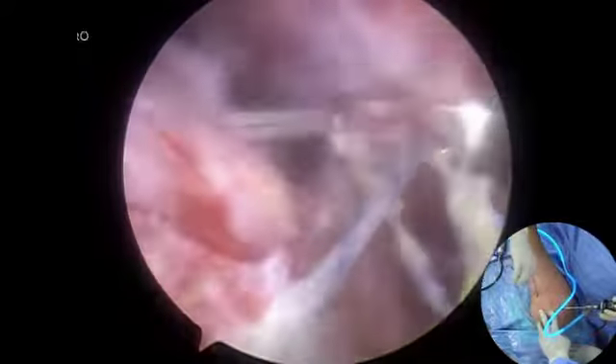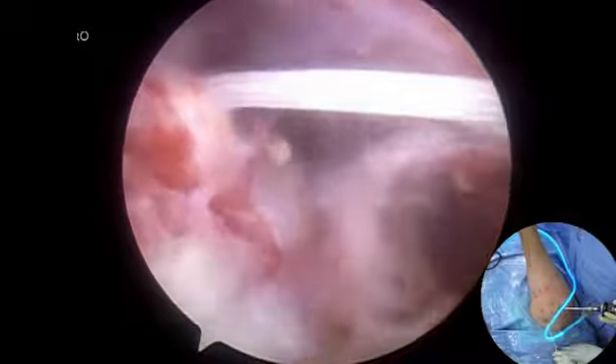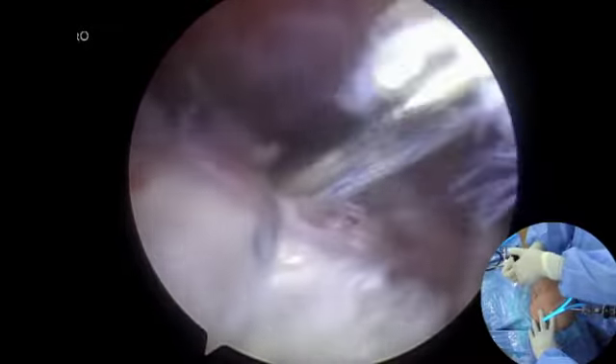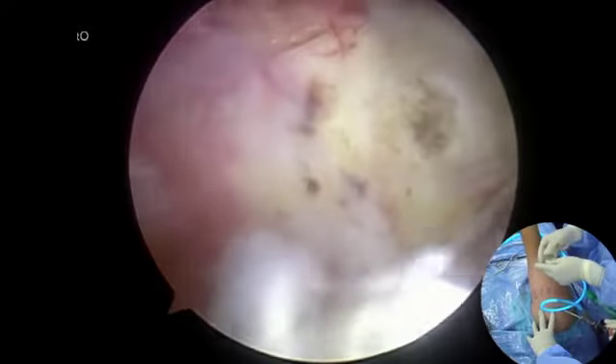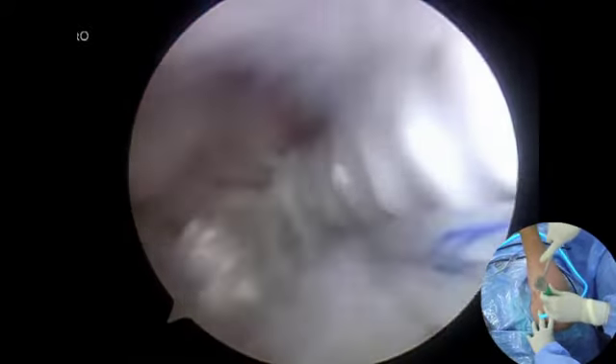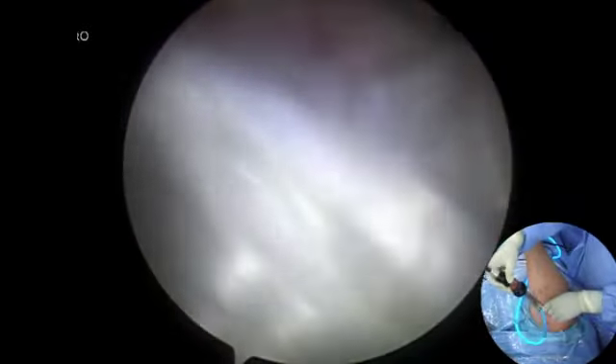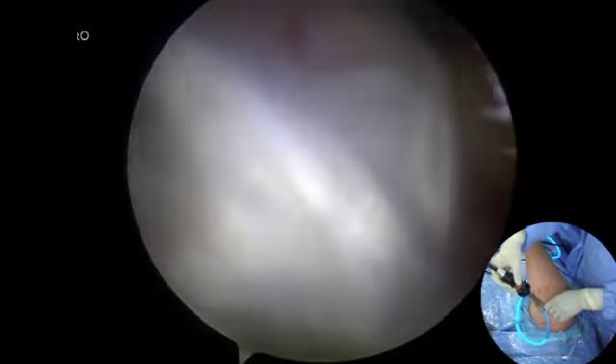The scope is placed into the anterior subdeltoid space. The two ends of the infraspinatus graft are fixed by tying the sutures over the bone bridge. The scope is then placed into the lateral subdeltoid space. The two ends of the supraspinatus grafts are fixed with a knotless suture anchor.